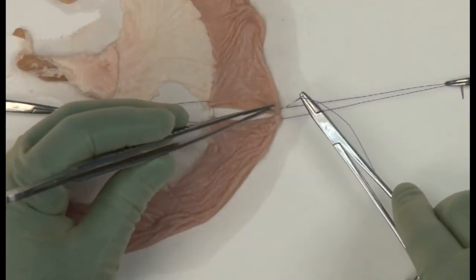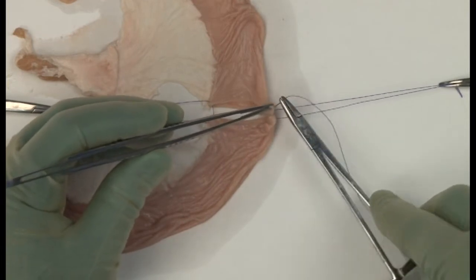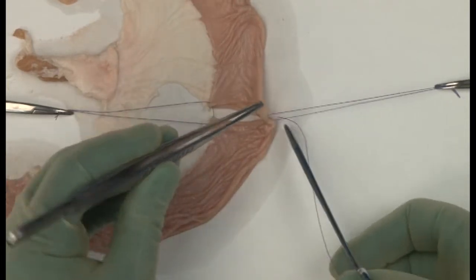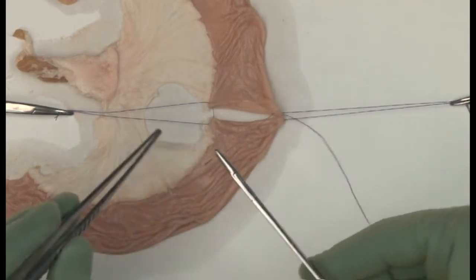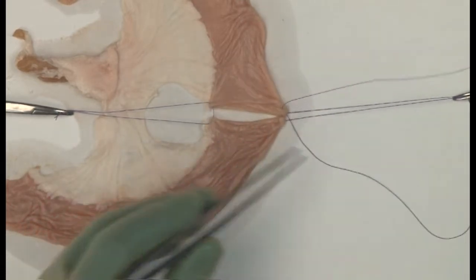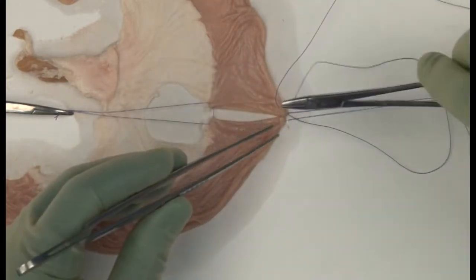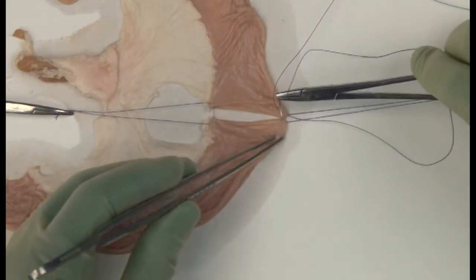And now we have the bowel nicely controlled and set up for an interrupted sutured anastomosis using a braided absorbable 3-0 suture. For practice you should hand-tie all the knots with carefully laid reef knots.